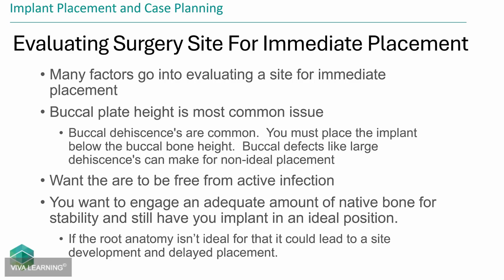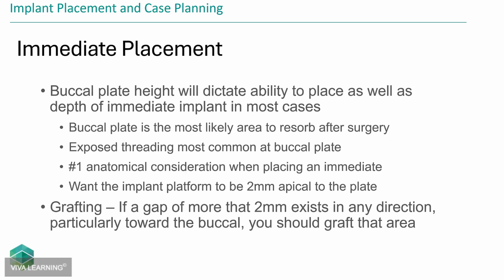You have to evaluate the buccal plate. You have to try to be free from active infection, and you want to engage as much bone as you possibly can. And if you impinge on that buccal plate with your implant, it'll create more bone loss than you hope as well, which is why you want to lingualize your implants as much as possible. You want to push those to the lingual and graft or let natural bone form around the buccal side.